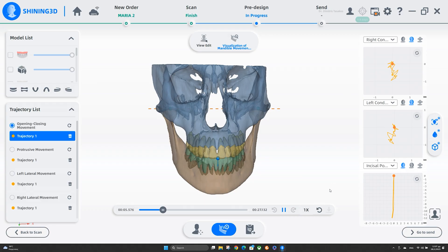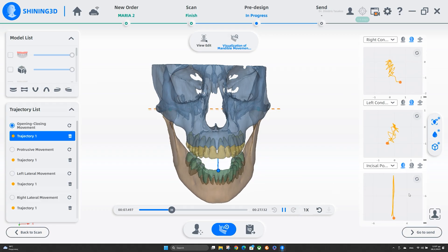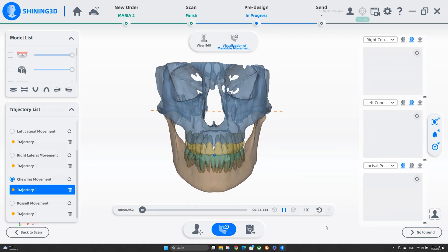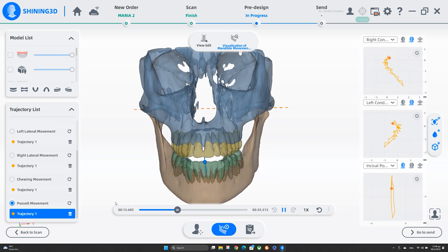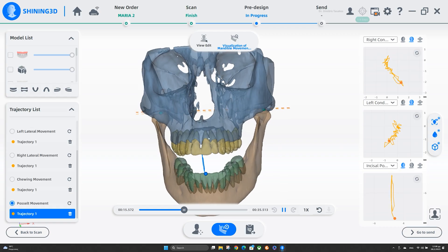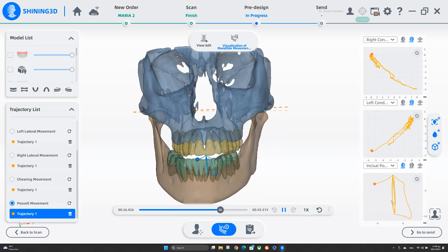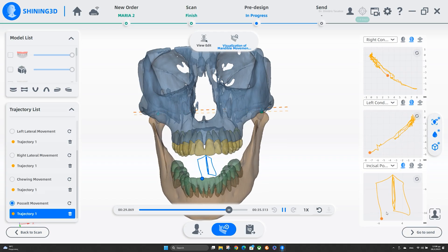It also helps us determine the hinge axis — whether we are close to the real hinge axis according to the motion or not. The third module is the mandibular trajectories with DICOM files. We can import DICOM files so we can have the diagrams of the motion and evaluate if it is normal and smooth or not.